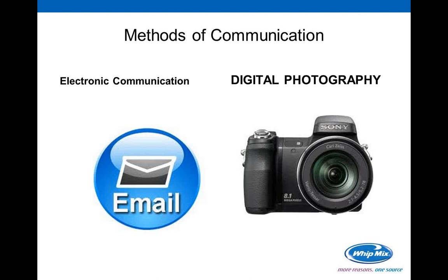Both of you can get on the telephone together, and while he's looking at the photograph, you're looking at the real thing, and you can talk about the problems that you're going to run into. It's a great way to communicate. So if you're not doing it, once again, you need to begin. You need to begin.